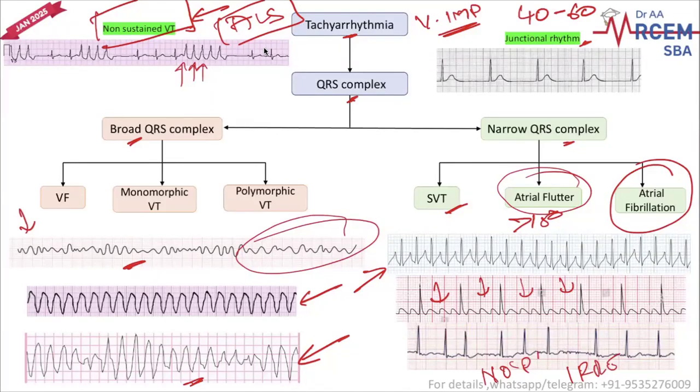All right, we'll be going ahead. Any questions? Yes, sir. Good afternoon. I just wanted to ask about idioventricular rhythm. Is it in only one lead or more than one lead?